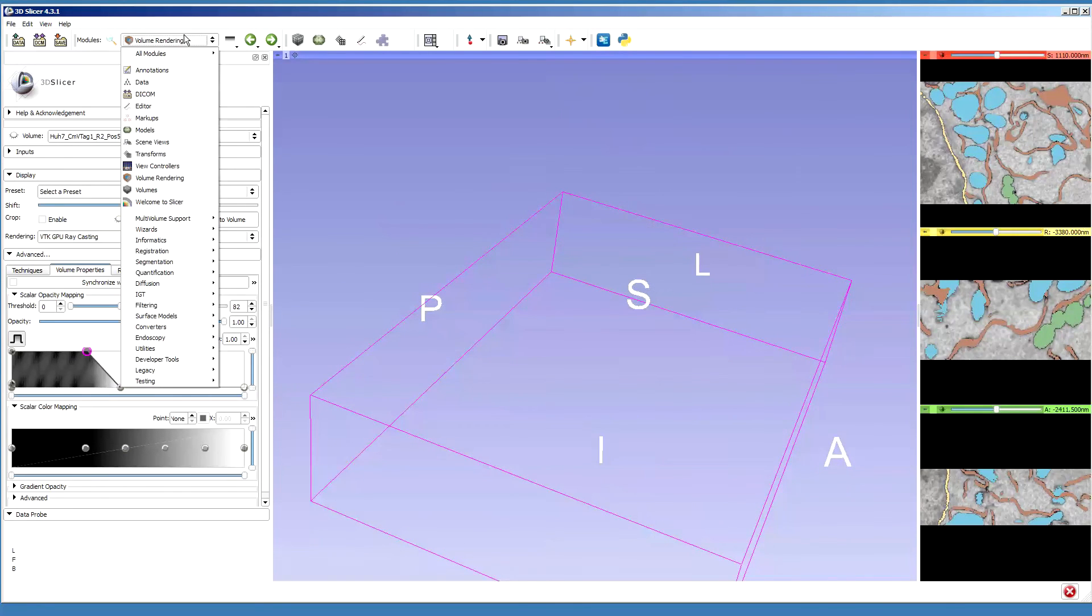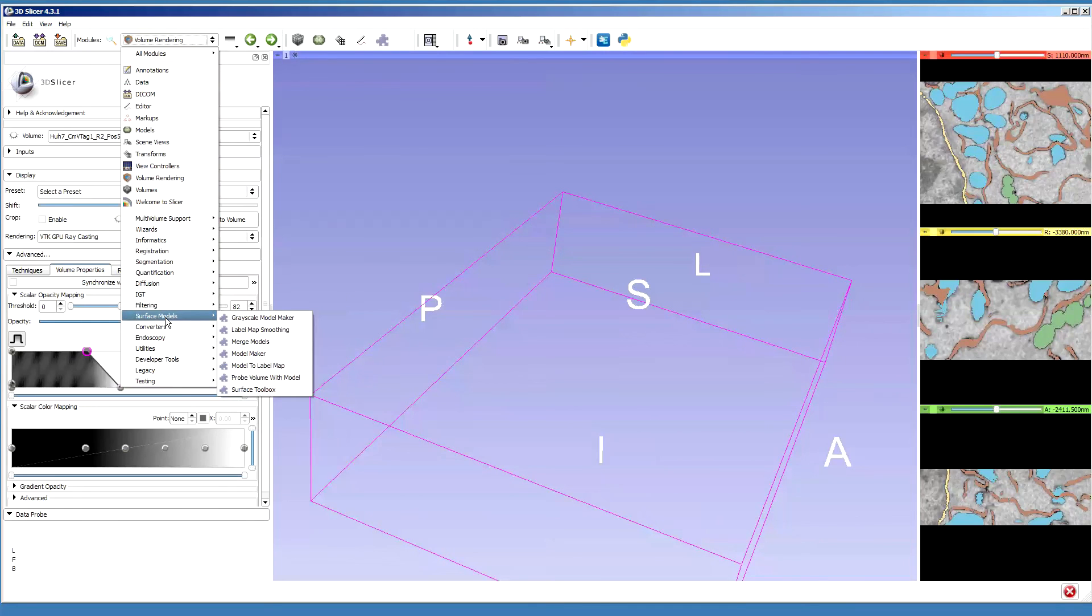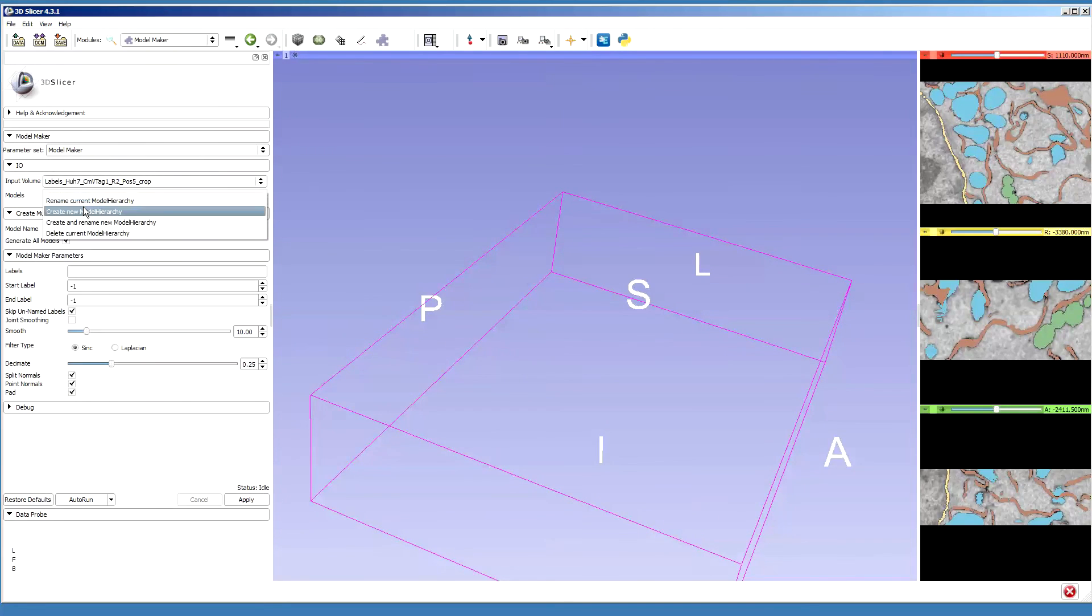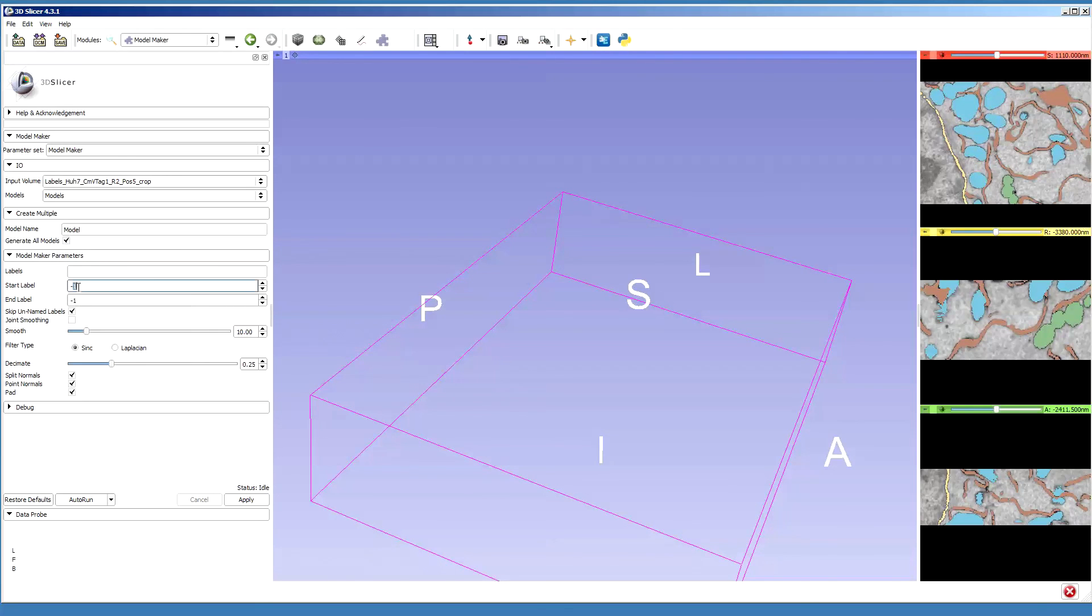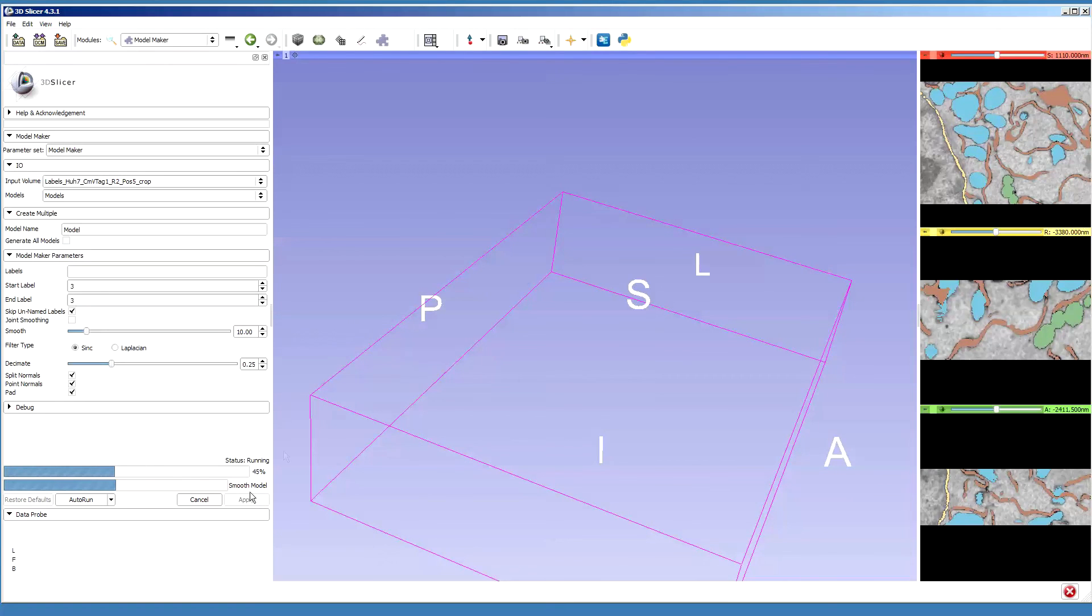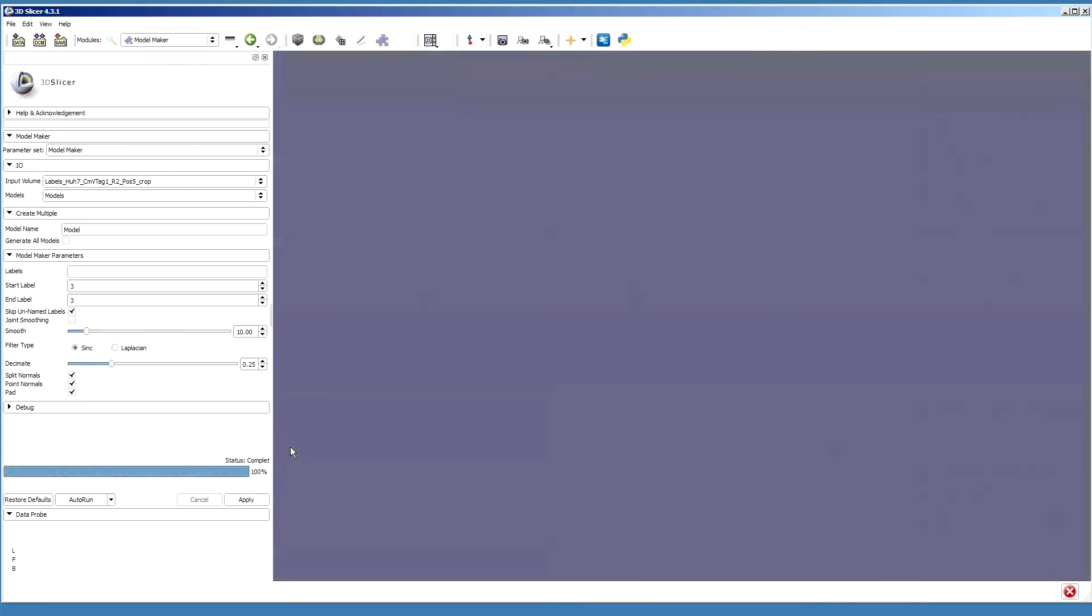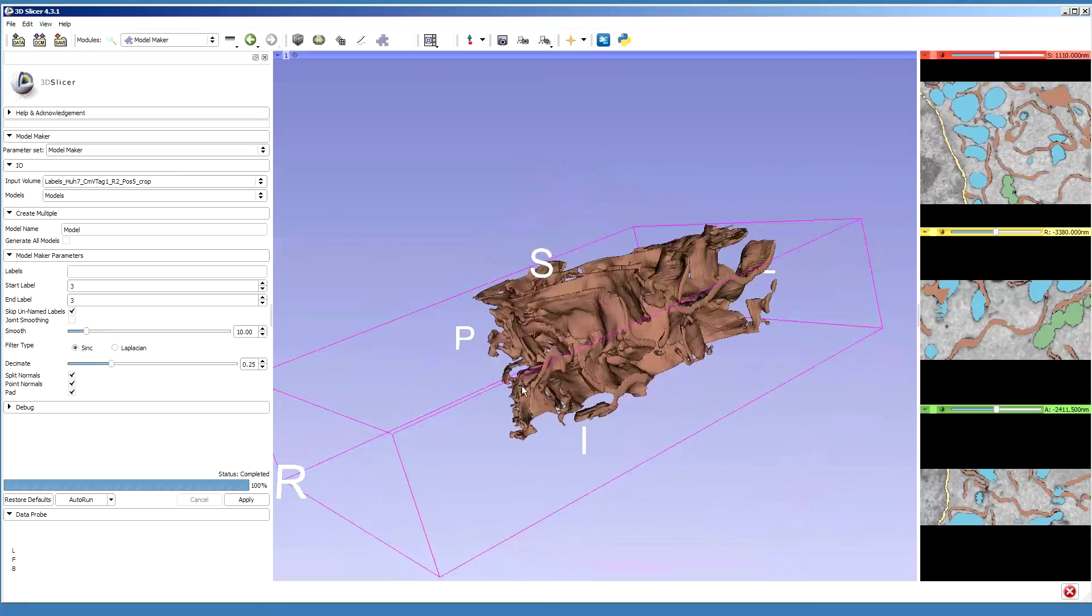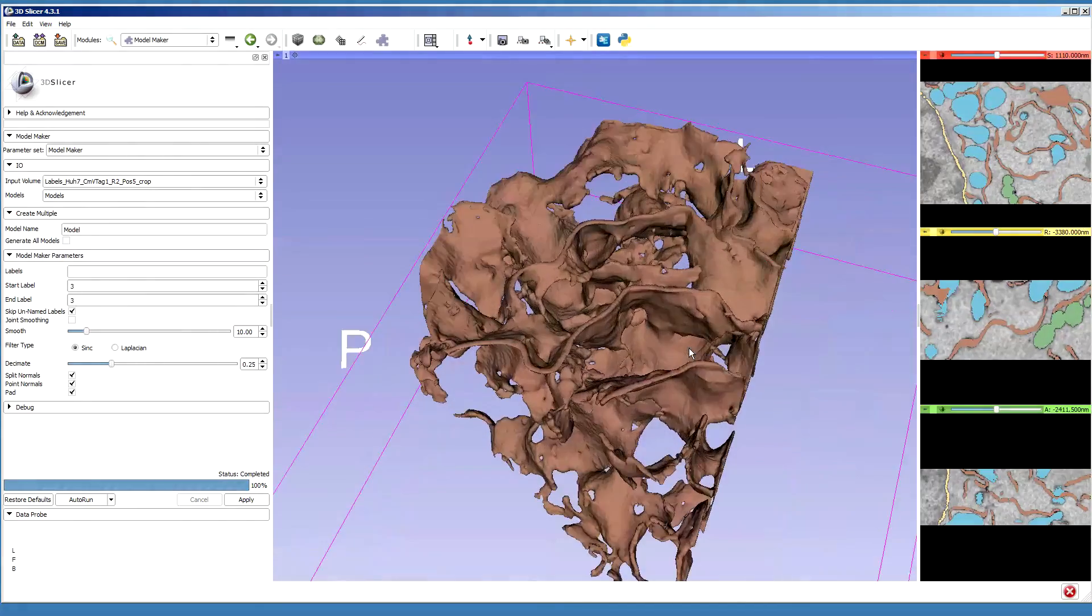And the same, I can use the surface models model maker to generate the model. So I select the labels, create new hierarchy here, and then I can take label 3 and press apply. It should render now the endoplasmic reticulum only. Yeah, so we can see it now on the screen.